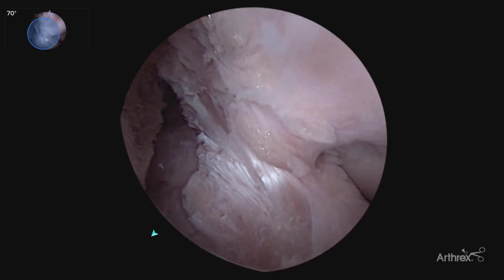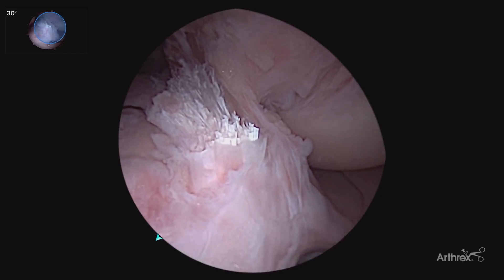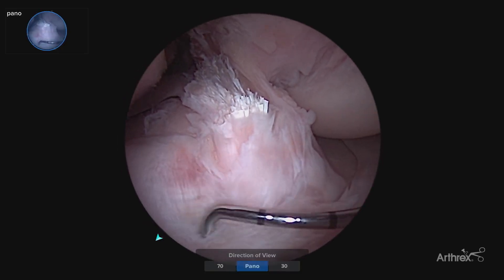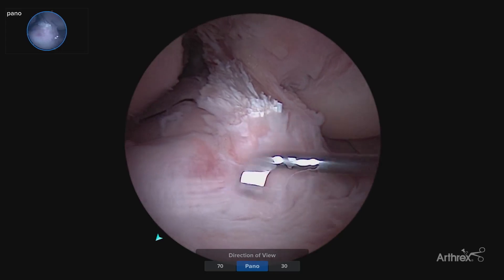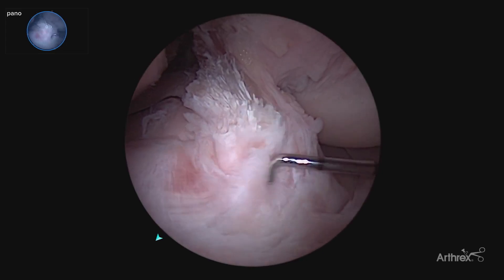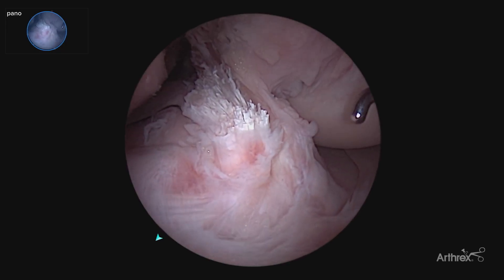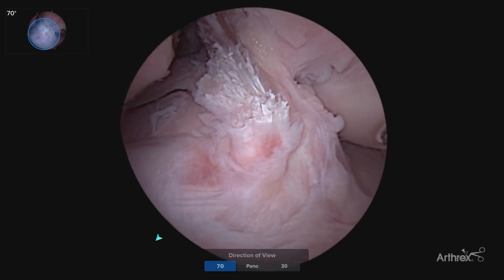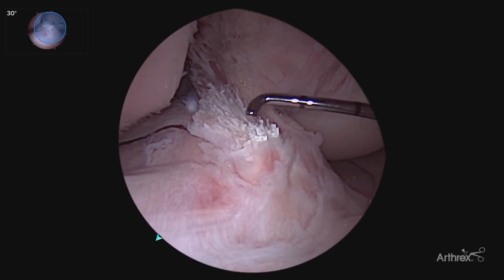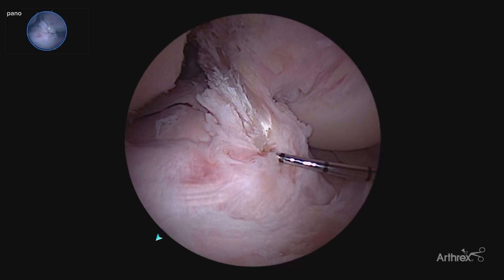Coming down to the tibial footprint, we'll go back to our standard 30 degree view. Often it's hard to see ACL material — graft material — flipped over here in front of the intermeniscal ligament. Now with our panascope, it allows for that easy view all the way in front to be able to see the anterior horn of our lateral meniscus and any ACL material that may be flipped forward that can cause a cyclops lesion. This also allows for full assessment of very accurate tunnel placement as we place our guide. With our 70 degree scope having that similar view, our angular view with our 30 degree scope doesn't quite give us that full perspective. Now with our panascope, visualizing the entire footprint allows much more accurate placement of our tibial guide.